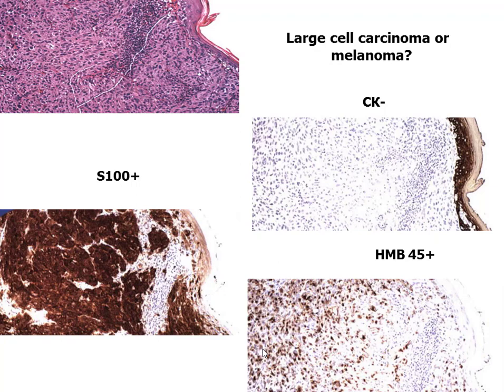So, what do we do? We use markers of cytokeratin, and markers of melanocytes, S100 and HMB45.